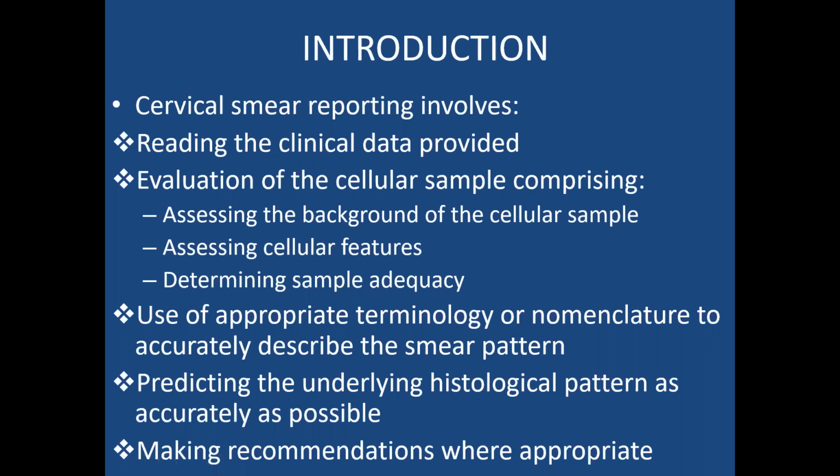So if you want to report a cervical smear, we receive a smear, we take it through the normal processes, stain and cover slip, and we are now ready to write a report or screen and report on that particular case. To do that, you first need to read the clinical data.